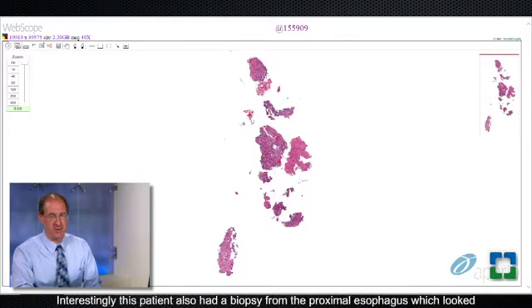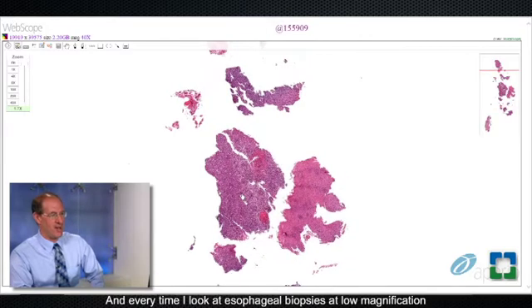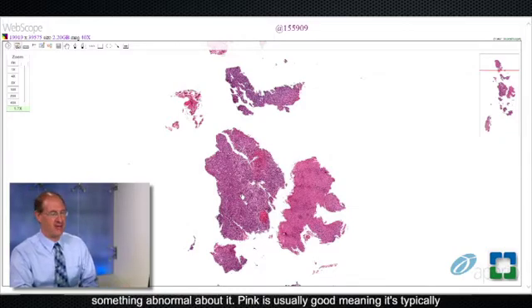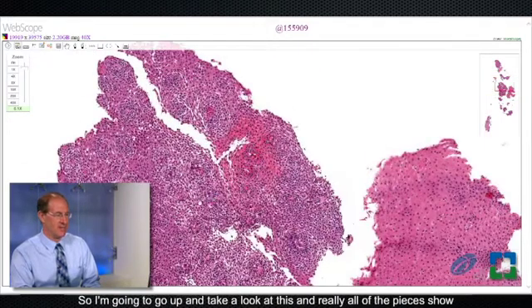Interestingly, this patient also had a biopsy from the proximal esophagus which looked pretty much identical. I look at all GI biopsies at low magnification, and every time I look at esophageal biopsies at low magnification, my first question is whether it looks pink or blue. Blue means it's inflamed, something abnormal about it. Pink is usually good, meaning it's typically not inflamed because of all the glycogen in the esophageal squamous mucosa. At low power, this biopsy looks quite blue.